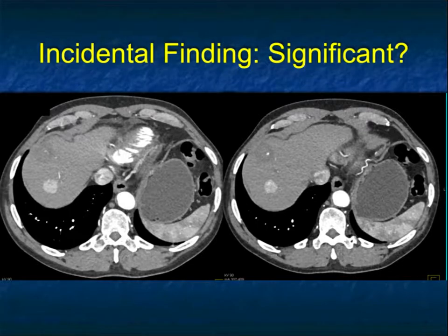So with that, we've covered FNH. I've gone through a lot of the key points. We spoke about it relative to hemangioma, the importance of multiple lesions at the same time, the challenges of how FNH can overlap with other lesions, but the importance of recognizing it's a benign lesion and a leave-alone lesion. So with that, I'll stop there, and I'll be happy to take any questions.